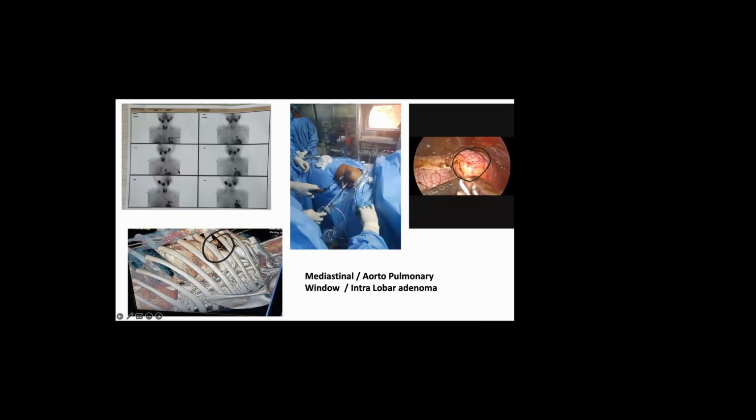So this is one of the cases of my senior where he did VATS parathyroidectomy because the adenoma was in the aortopulmonary window. So this is how the MIBI scan is going to be helpful. If we just do a neck imaging, we may miss all these things. So we should not get away with functional imaging for the patients of PHPT.